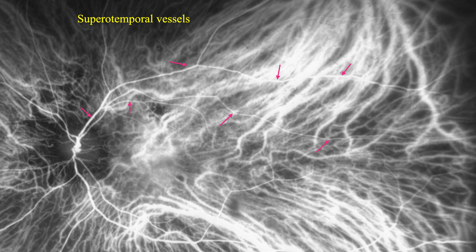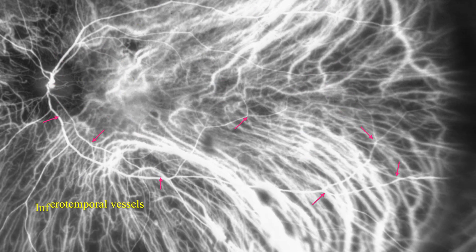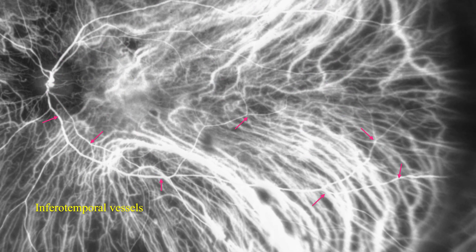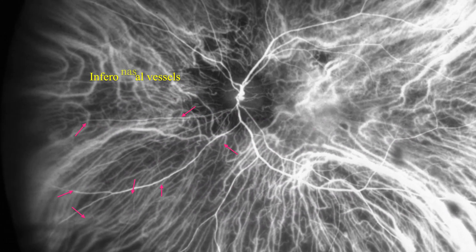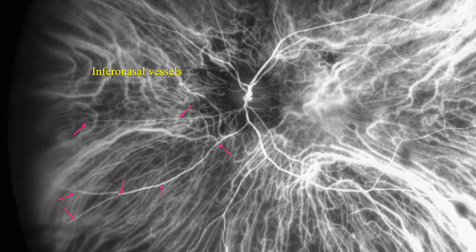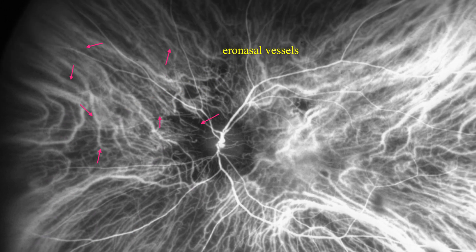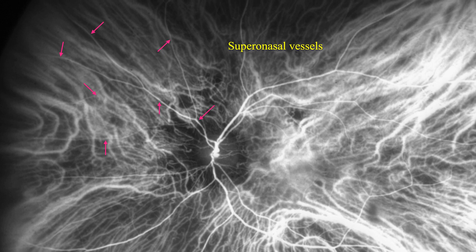Here you can see the superior temporal retinal arcade, inferior temporal retinal vessels, inferior nasal retinal vessels, and finally the superior nasal retinal arcade.